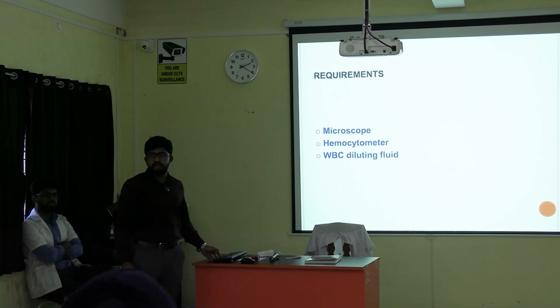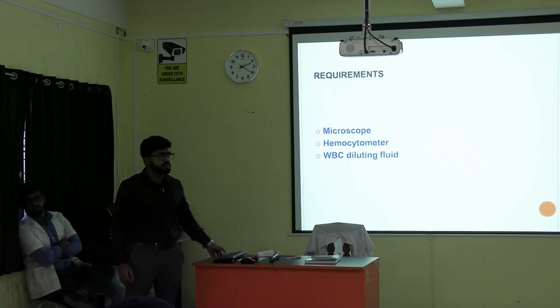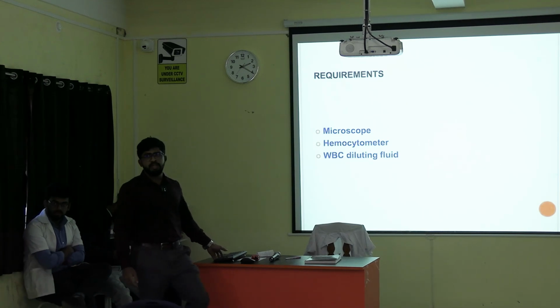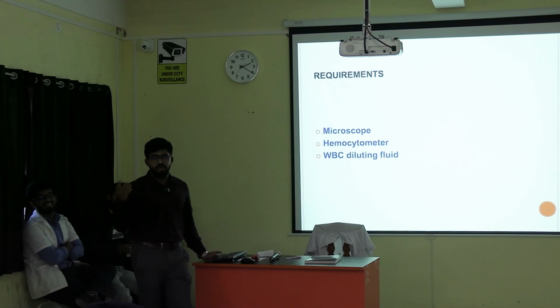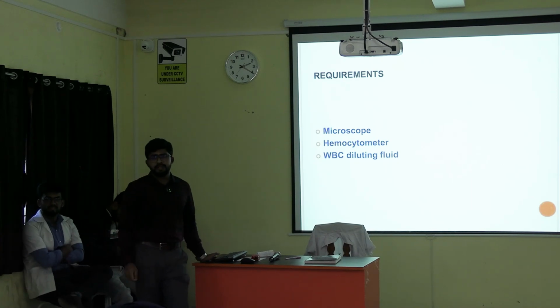What is the full form of EDTA, anyone? And how does it function? Chelating what? What is the thing that is involved in your coagulation cascade?